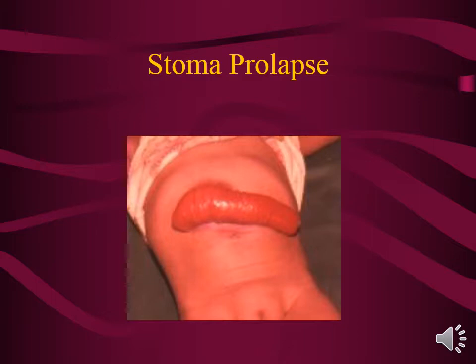And typically these types of stomas are for diverting stool and are not going to be permanent, and so that's what a stoma prolapse looks like on a kiddo that has been crying and exerted that abdominal pressure. And so our biggest goal here is to keep that from getting cut, so we're going to protect it.